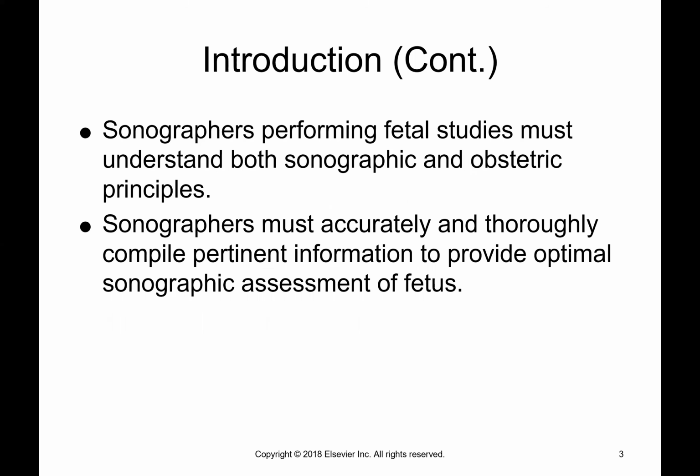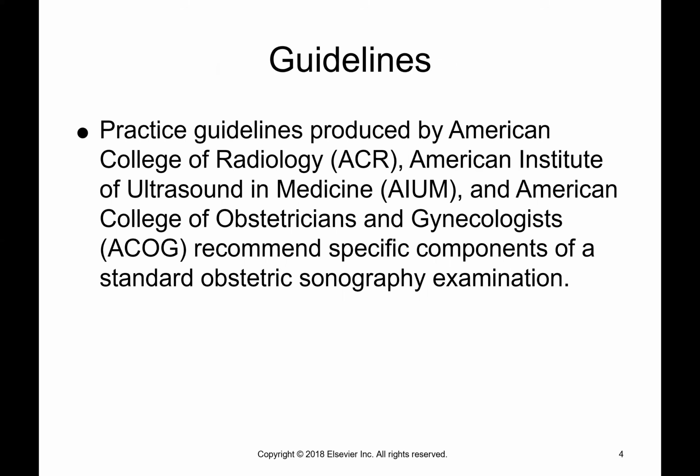Sonographers must accurately and thoroughly compile pertinent information. What that means is basically, I'll teach you how to do measurements and what to look for in each scan to make sure everything looks well with the baby. And then we write up a report and give it to the doctor. We have guidelines that tell us what our protocols are, and these are from the ACR, the AIUM, and the ACOG, and they recommend specific components of examination, just like the protocols you've had with all the other things. There are also protocols for first, second, and third trimester scans.